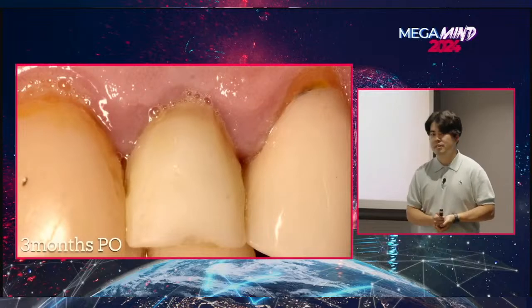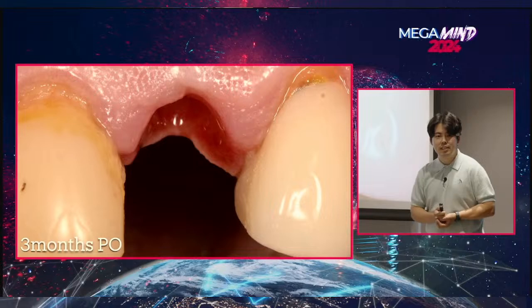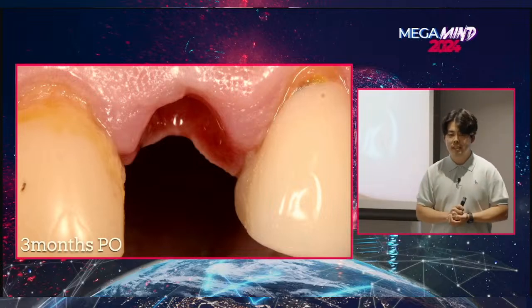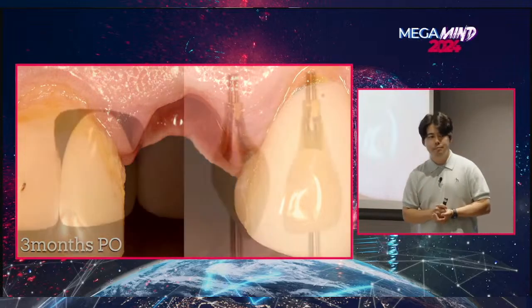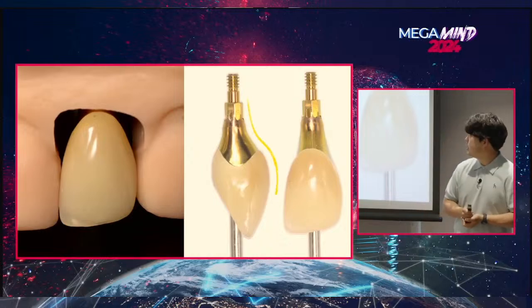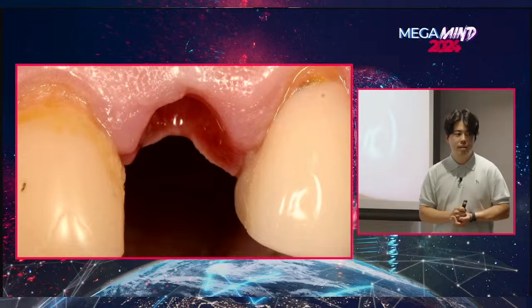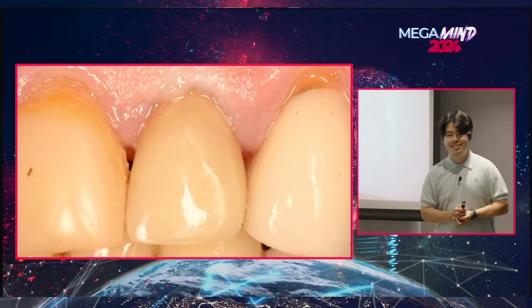Three months later, once we remove the temporary prosthesis, look at that tissue, right? It's ready for the final prosthetic. No tissue sculpting is needed because we already spent the time to create a perfect emergence profile. Here's the final prosthetic, created with a custom abutment and zirconia crown, and the tooth inserted in his mouth. Beautiful, right?